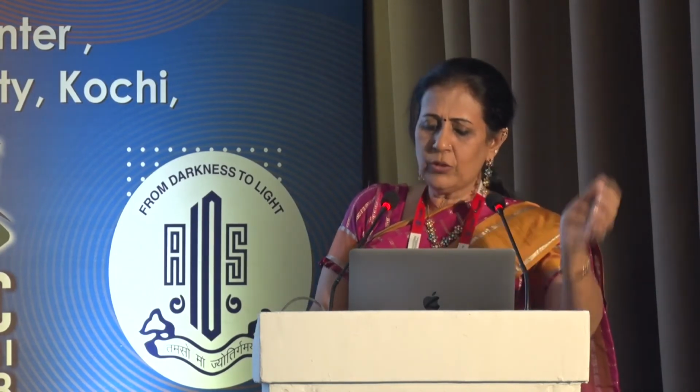This is one of those cases wherein there is a lens coloboma. There is a possibility of zonular weakness there, absent zonules in that area. I should have probably placed a CTR at the earliest after making the rhexis, because there could be fluid misdirection in these cases. But I placed my rhexis a little away from the area of zonular weakness, because there could be lack of traction in that area.